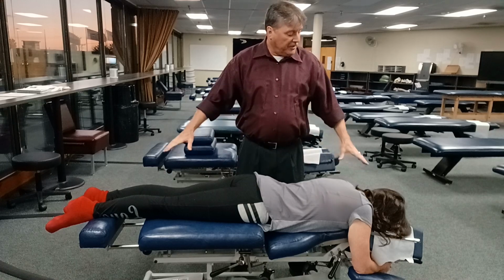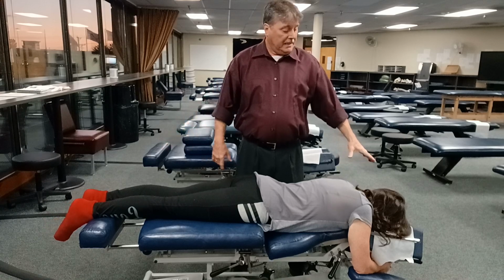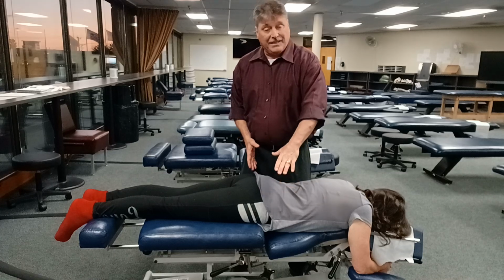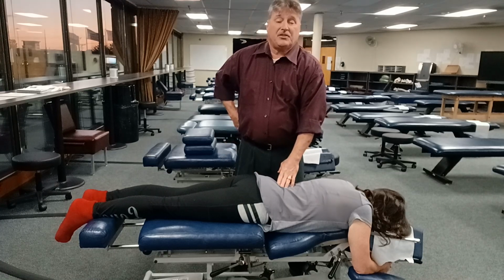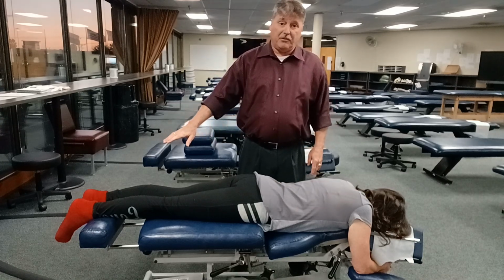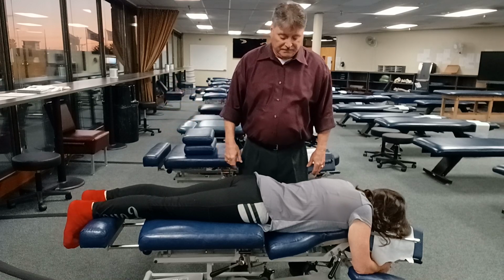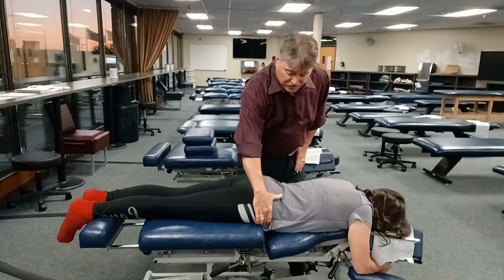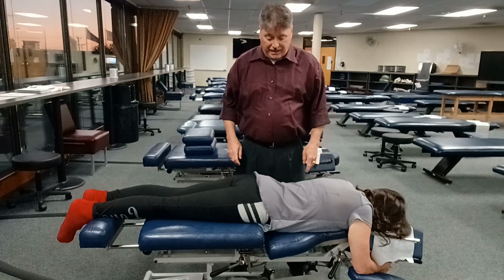Now, first thing I need to do is to make sure my table is set the way that I want it. Headpiece is slightly down. Thoracic piece is slightly lowered to create extension and pretension in the lumbar spine. And the pad of my foot piece is underneath the ankles of the patient to support the lower extremity. Now, also, I want to have the patient's ASISs just at the top edge of the pelvic pad.